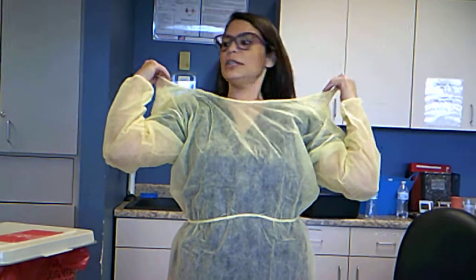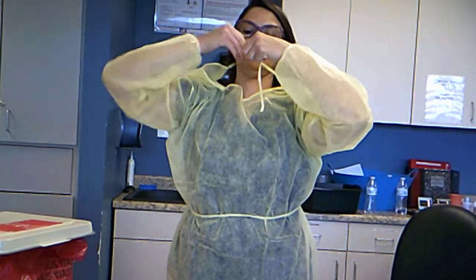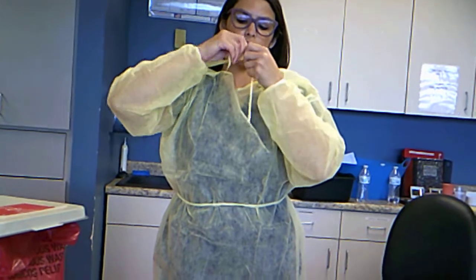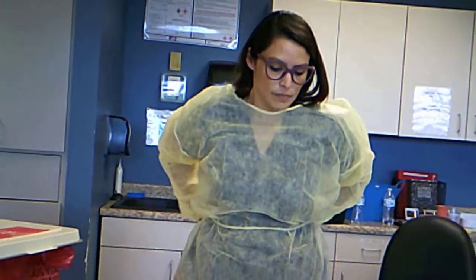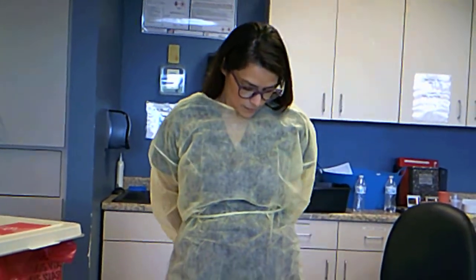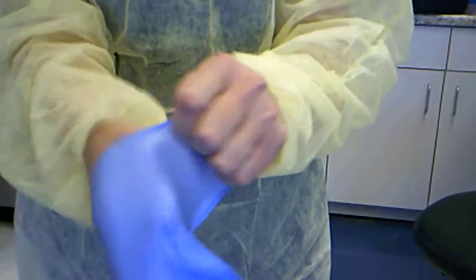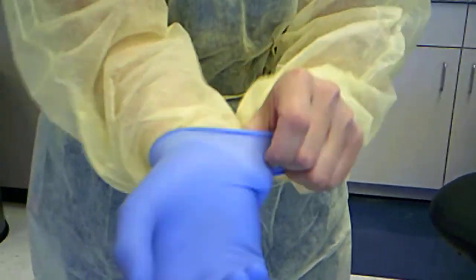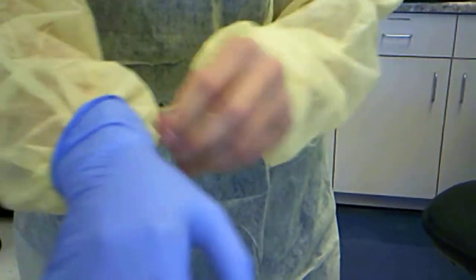If you're putting on a fresh gown, you can tie this in front of you and flip it over your head. I'm going to put my gloves on. I just want to make sure my gloves go over my gown.